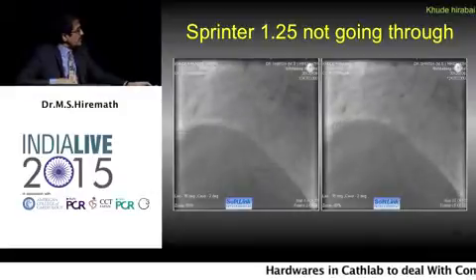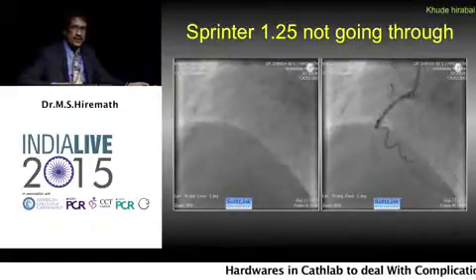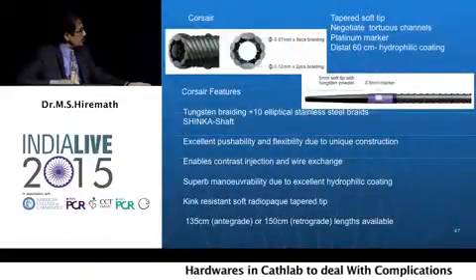In this particular case, you have a wire down, but a Sprinter is not going. And here we bring in a Corsair. So you see Corsair going very easily through this.